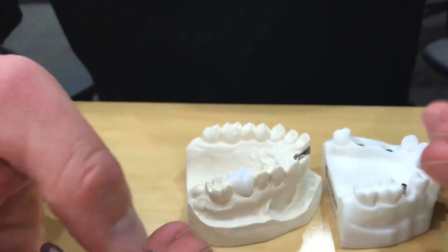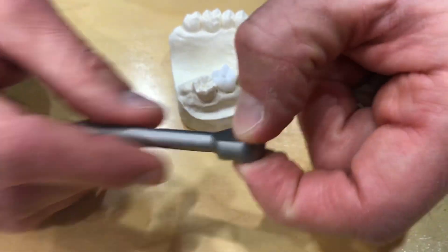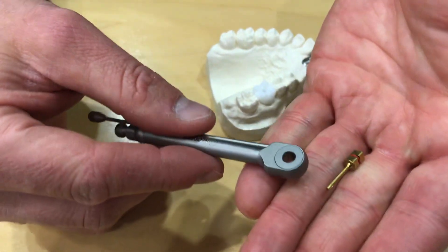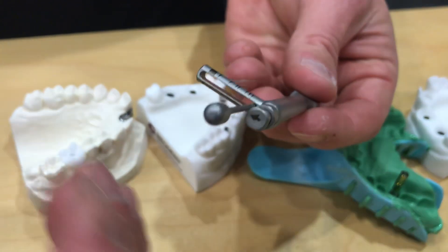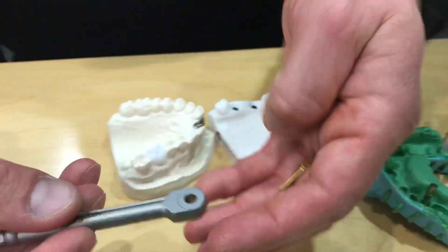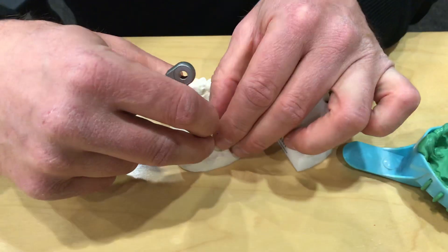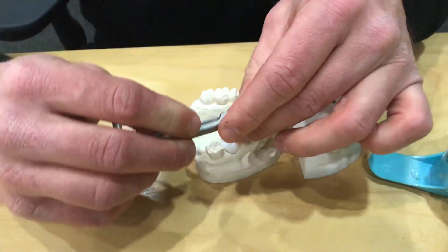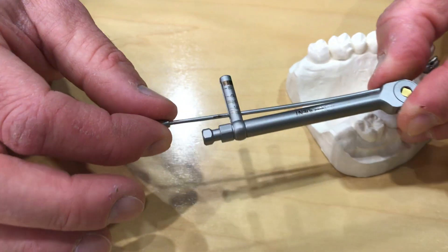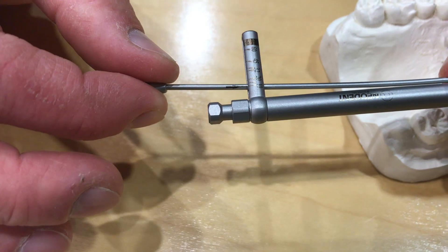We take our torque wrench and make sure we see NEO down on the top, with the bar facing us. We always make sure that the round component on the end that accepts our screwdrivers has the square on the bottom. We have an arrow on the end of our driver — we want to make sure the arrow is towards us: T to T, towards to tighten. With those three things set up properly, we place our abutment down, turn until it's nice and tight, drop our wrench on, and we're only tightening to 20 newton-centimeters. That's all we need with the Morse taper. And that's it, folks.